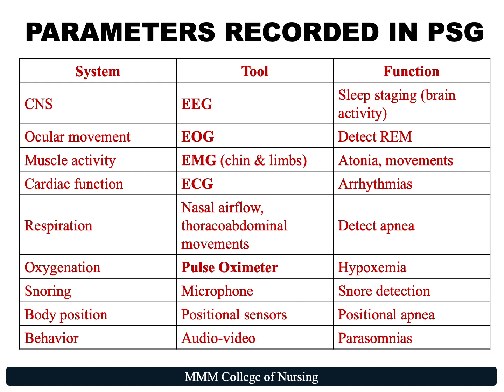The next one is to see the cardiac function, and the test used is ECG, which is electrocardiogram. This is a quick painless test that records a heart's electrical activity, showing its rate and rhythm by detecting electrical signals from electrodes placed on the skin, help diagnose heart attacks, arrhythmias, and other conditions by revealing the pattern of heartbeats. So here in PSG, this helps in detecting arrhythmias.